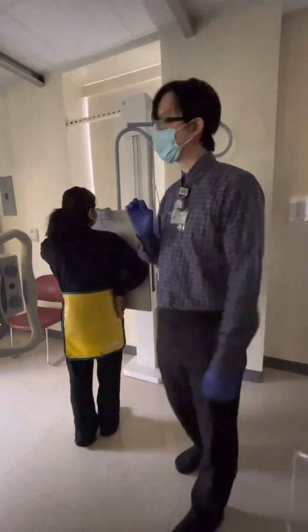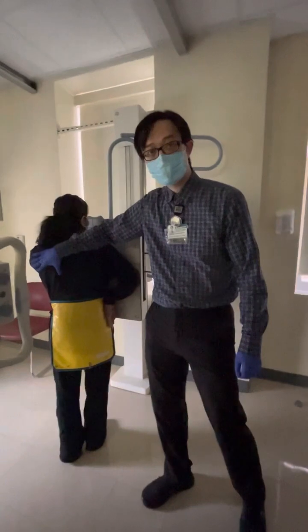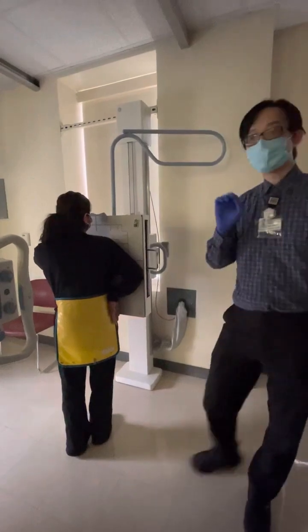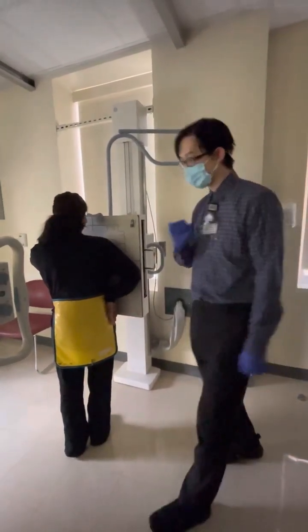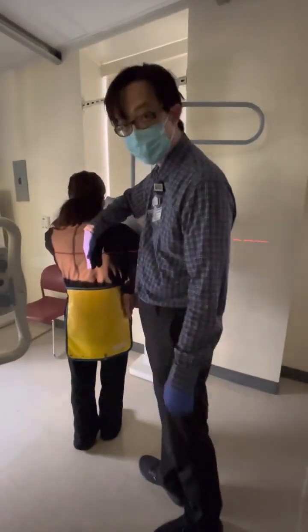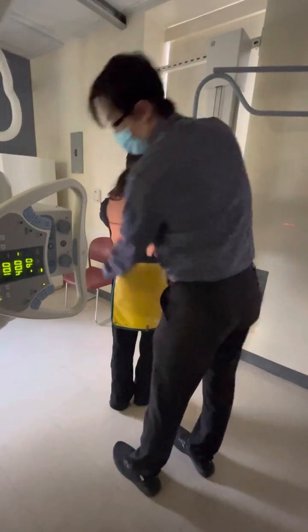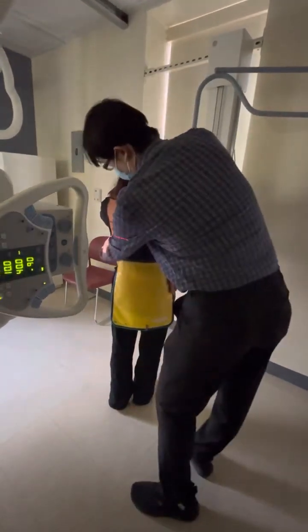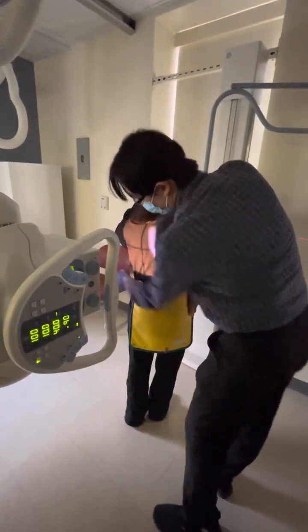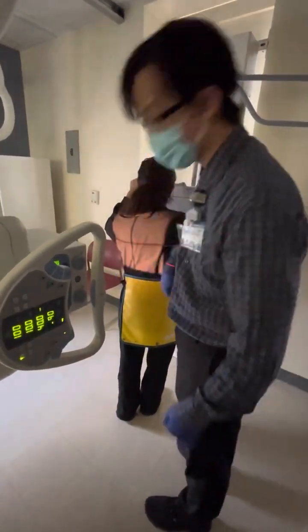However, some places may ask you to do unilateral ribs. They're like, if we only want the left side, then only shoot the left side. And so the centering will be slightly different. In this case, if we are looking at only the left side, once again, we've got our MSP here, but instead of going to the MCP, we're going to go to the side of the patient. So MSP, here's the side of the patient. And so we're going to be centered in between MSP and the patient side.